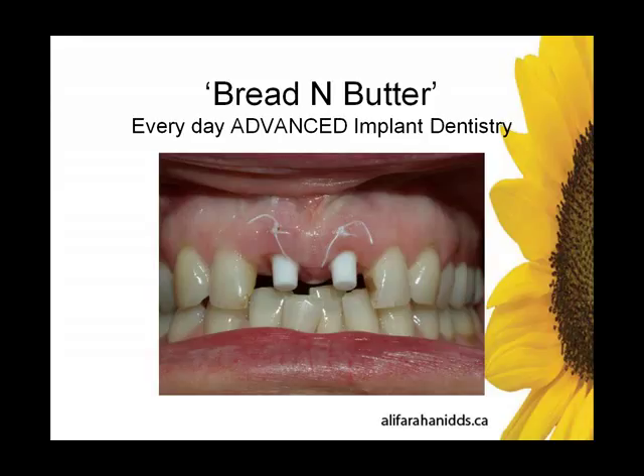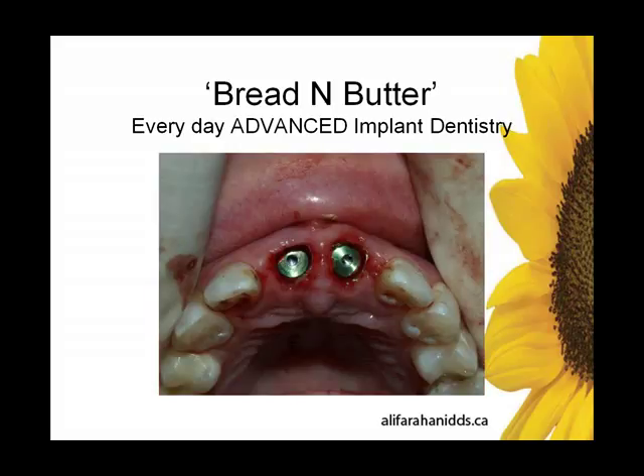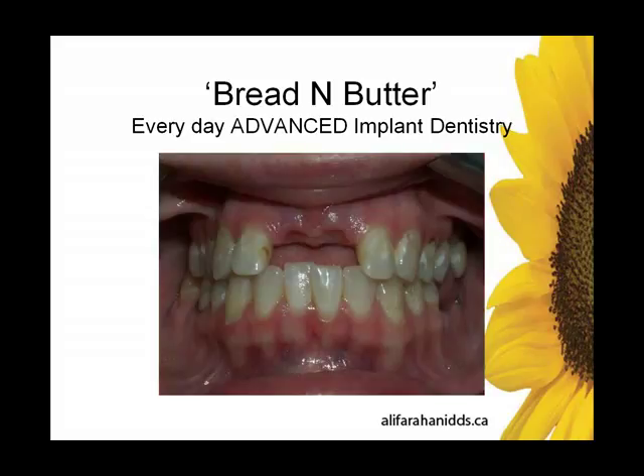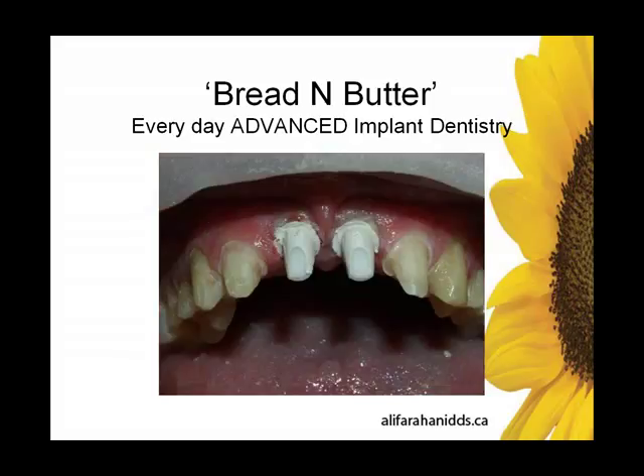At least, here are my impressions. I looked back in my files and compared this to other immediate titanium implants placed in virtually the same exact clinical scenario. There are significant aesthetic and management differences. Here are two titanium implants placed immediately — the titanium case was finished up with a connective tissue socket shield technique taken from the tuberosities. The same titanium case again seven months later, after all the contacts were used on the flipper to get decent soft tissue architecture. Nine months post-surgery, of course, a second-stage surgery is needed. Temporary plastic abutments, temporization of ten anterior units for a smile enhancement case.